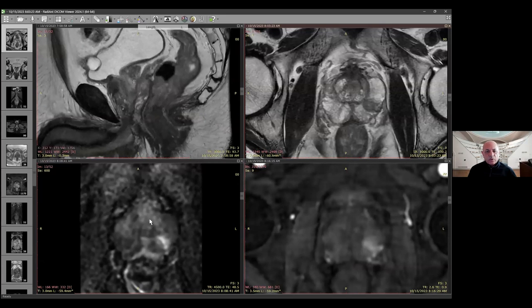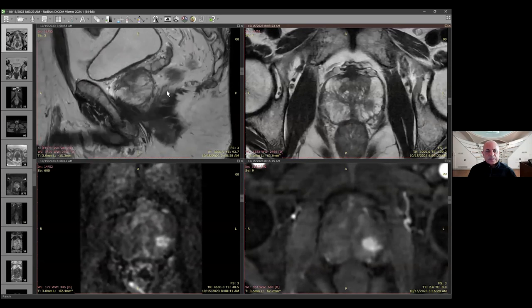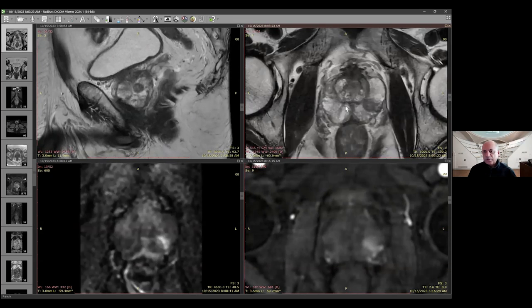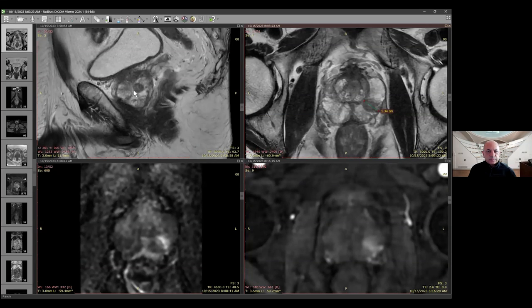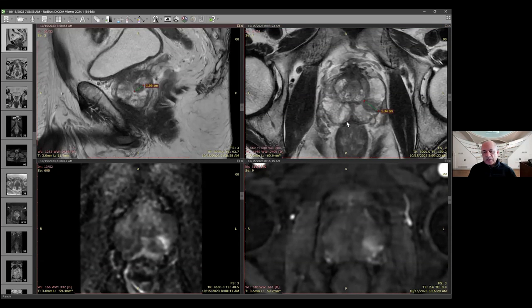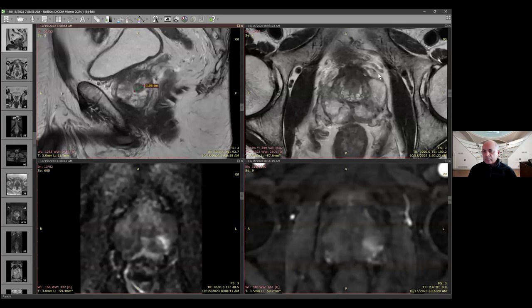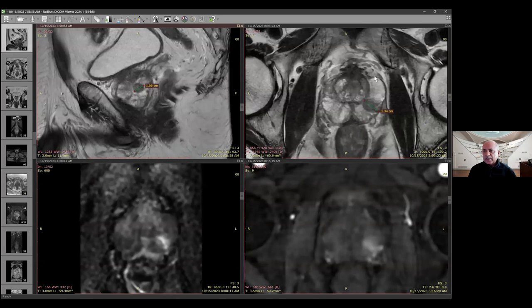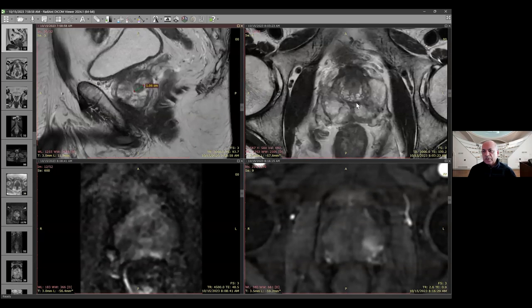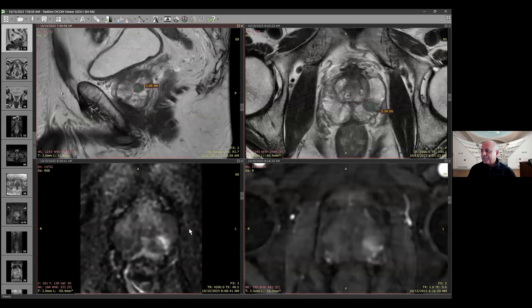We obviously need to measure. The question is where do you measure — we try to measure where you see it best, usually in two different planes to get a sense and then give the maximum dimension. In this case it measures approximately 1.4 centimeters. Going by the classic PIRADS 2.1 descriptions in the peripheral zone, this is less than 1.5 cm, we don't see obvious extracapsular extension, so this would be a PIRADS 4, and you would mark the lesion for them to sample.